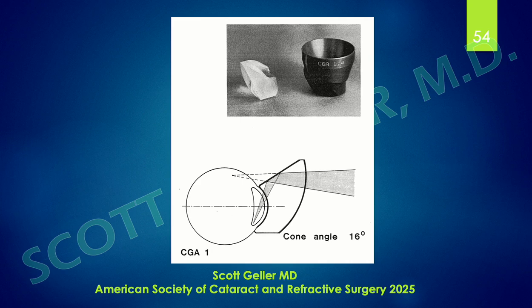In the angle of the eye, you can use a special lens. I use this lens for getting behind an implant towards the pars plana. It's a little difficult to do, but with some good expert teaching, it can be done. And it's very useful in younger patients that have vitreous opacities that tend to lodge in the pars plana region, but the patient finds them extremely annoying when they go in front of their visual axis.